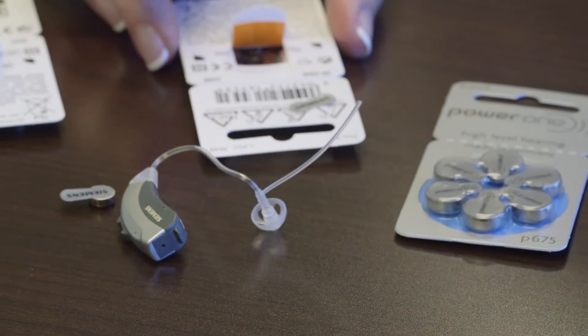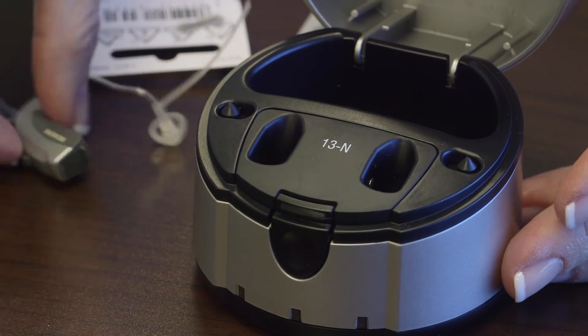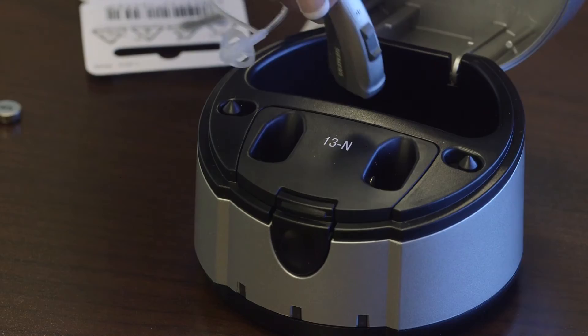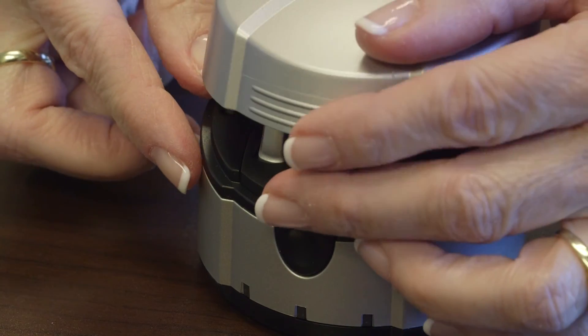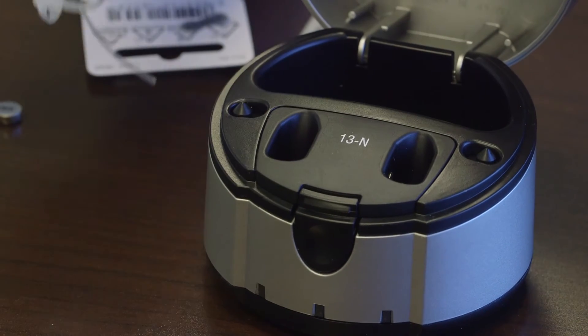Some hearing aids use rechargeable batteries, where you would put the battery into the hearing aid and then place it into the charger. Close the charger overnight, take it out in the morning, and put your hearing aid on.